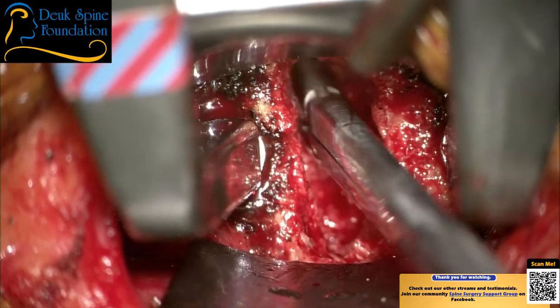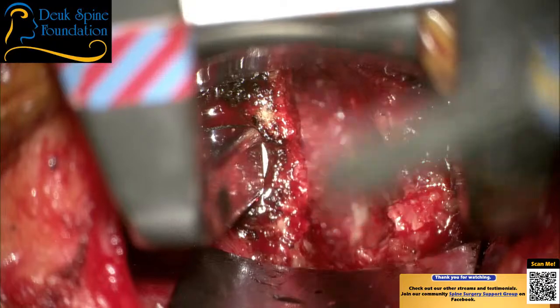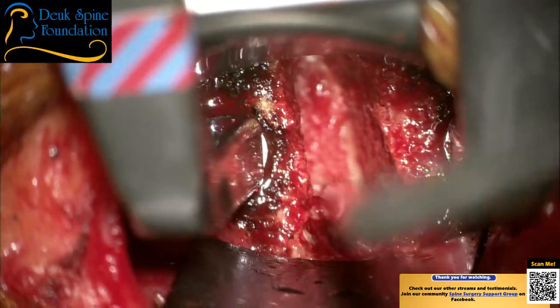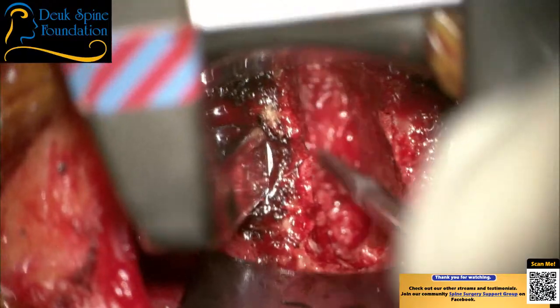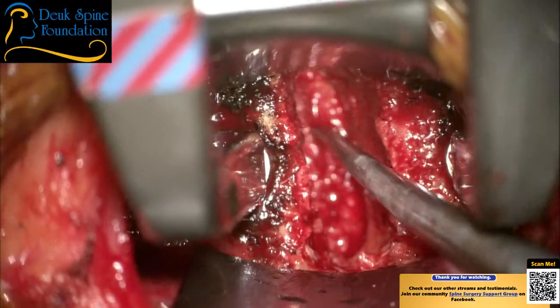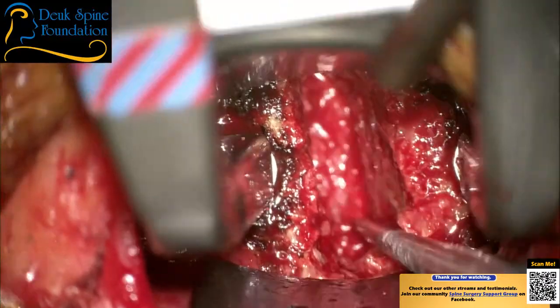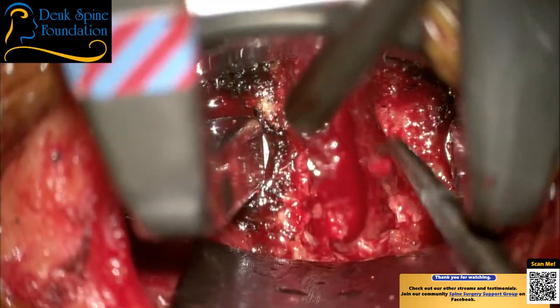A lot of people think herniations come out in one piece, but they don't. They actually come out in many, many fragments. And this patient's no exception. Look at all this red stuff. This is all highly, highly inflamed tissue. So a lot of inflammation going on right here. Suck, please.